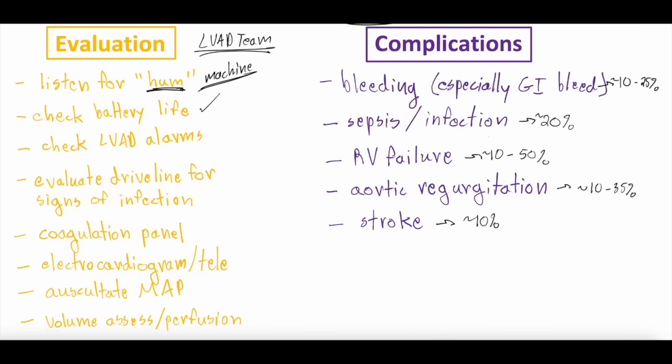All right. Look at the LVAD to see if there have been any recent LVAD alarms. Remember, future video, but this gives you a lot of insight. If there have been alarms, you need to think about and address those alarms. If there haven't been, that crosses it off the list, right? The LVAD seems fine, there's a hum, good battery life, no alarms. That implies the LVAD's probably working okay. Certainly exceptions to that rule, but for the most part.